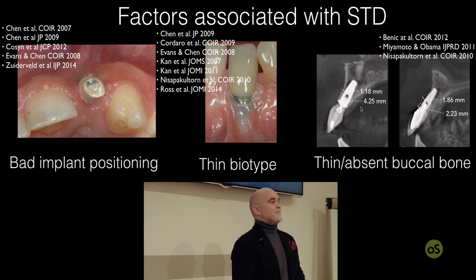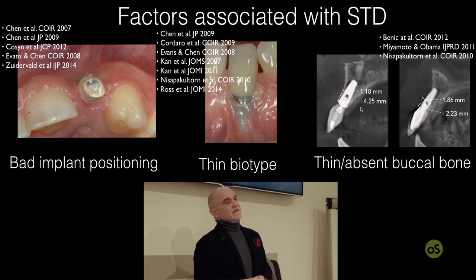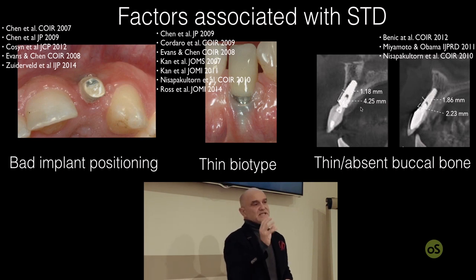The presence or absence of the buccal bone is something that can increase the risk of implant exposure, thread exposure, rough implant surface exposure.